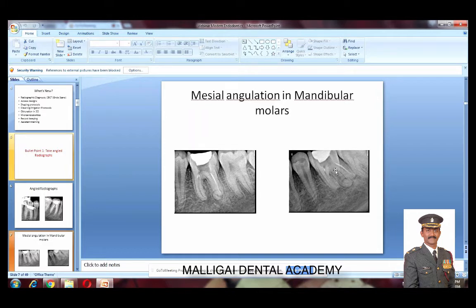Immediately, the extra lingual root, the distolingual root, has shifted away from the regular distal root. This was possible simply by taking an angled radiograph, and look at how much extra information is now available to you right at the stage of diagnosis.